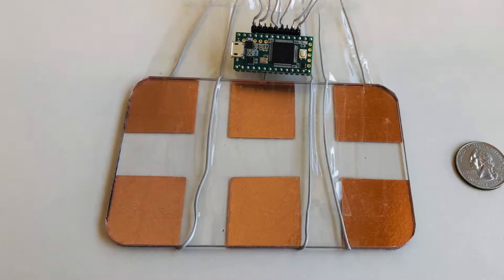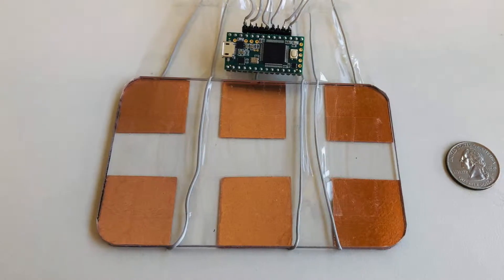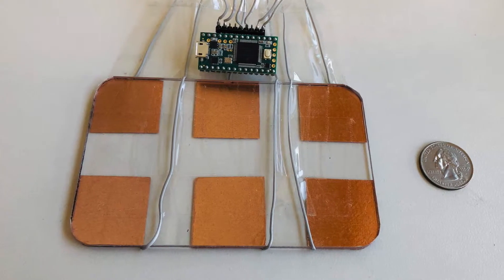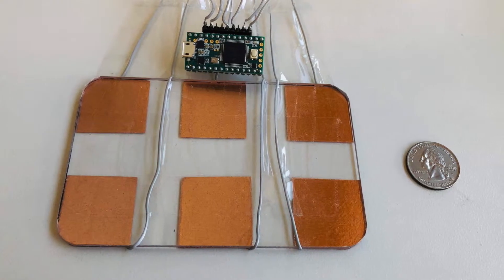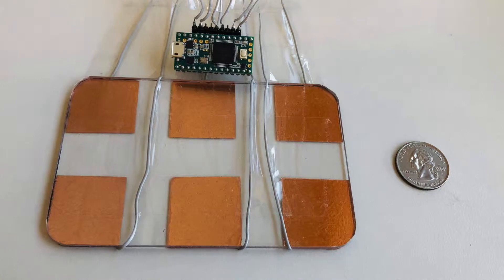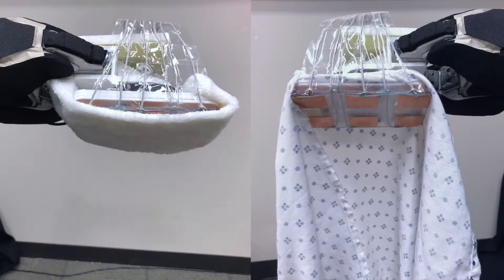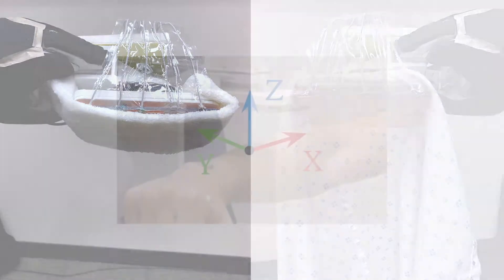Our capacitive sensor design consists of six copper foil electrodes connected to a Teensy microcontroller board. With this setup, we are capable of sampling capacitance measurements from all six electrodes at frequencies over 100 Hz. We attached the capacitive sensors to the bottom of an assistive tool, which allowed the robot to easily hold both a hospital gown and a washcloth.